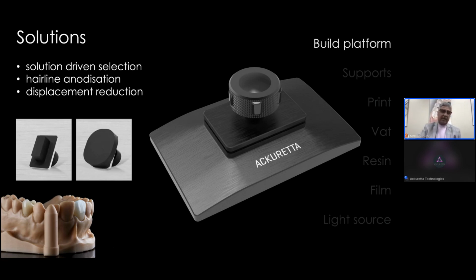So if you're printing with any of these platforms, be prepared to see an increase in speed as you go down the size. It does, however, depend on what kind of resin you're using. You don't necessarily see significant increases or decreases in speed with highly viscous resin, so be mindful of that. Doesn't happen with every resin, but it certainly happens with some resins.